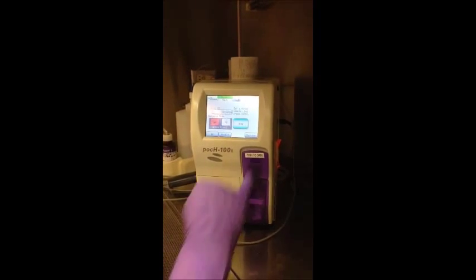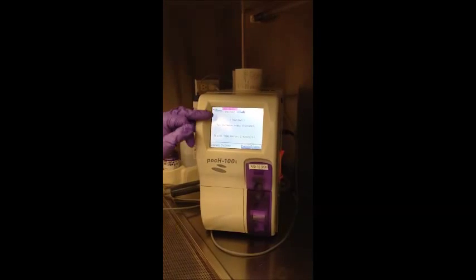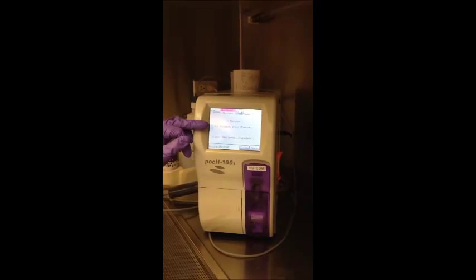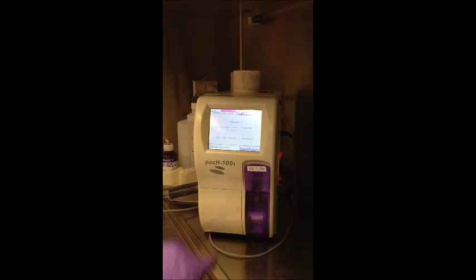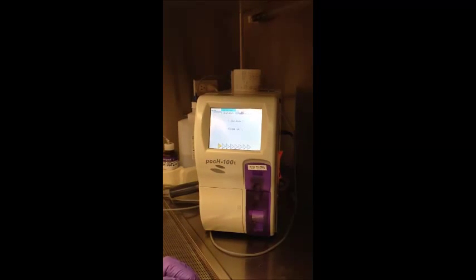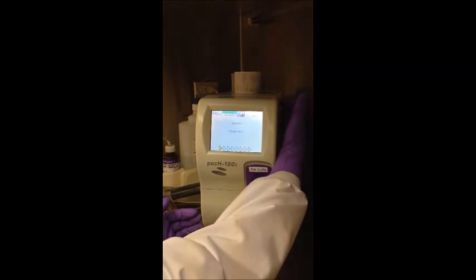Shutdown is really simple. There's a button here. Push it. On the screen it says Run Shutdown. Press Execute. The execute is on the screen. Press that. It will take approximately 2 minutes. And once this is shut down, turn off the power on the side.